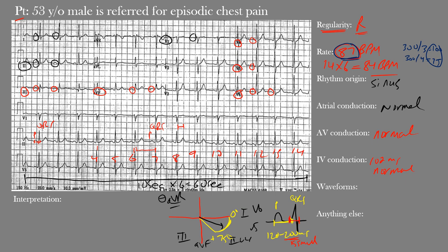For waveforms: the P waves are normal sinus P waves. The T waves are present, asymmetric, and appear normal. The PR segment is not significantly depressed or elevated. The PR and QRS intervals are within normal limits. The ST segment does not appear significantly elevated or depressed anywhere. The QT interval is 360 milliseconds and the QTc corrected for heart rate is 433 milliseconds. No major waveform abnormalities.